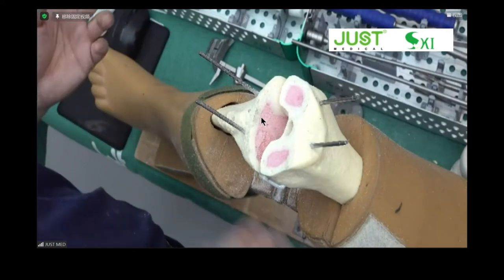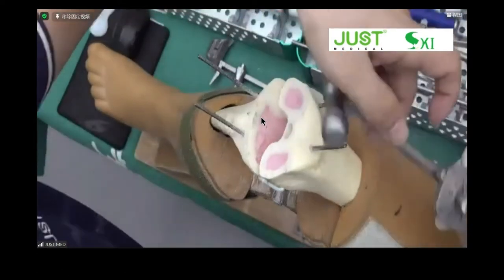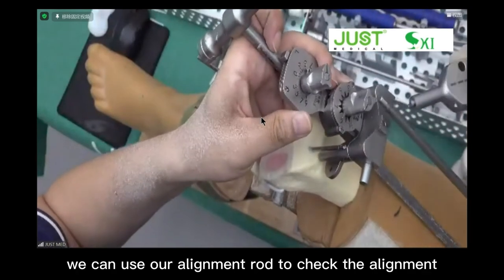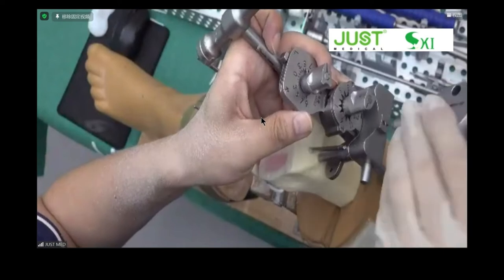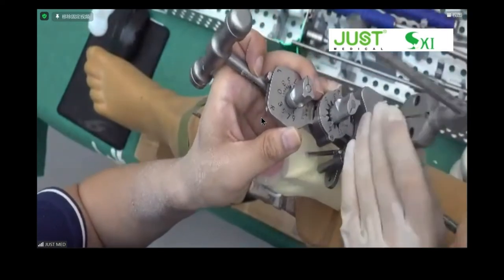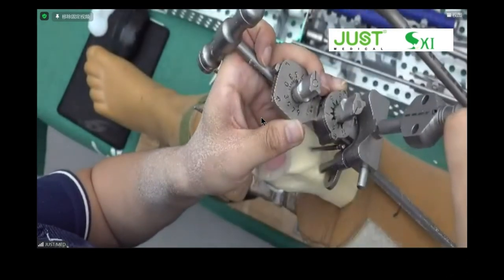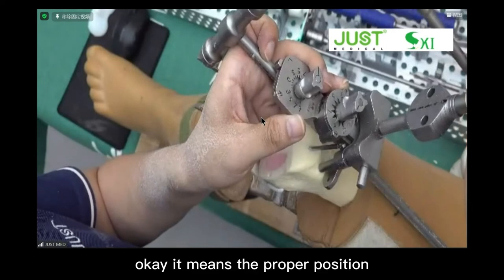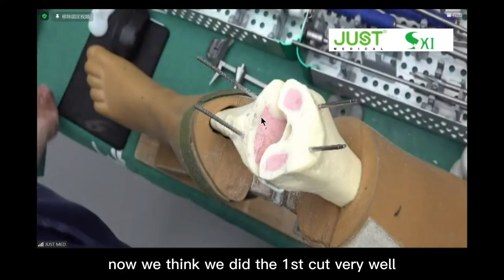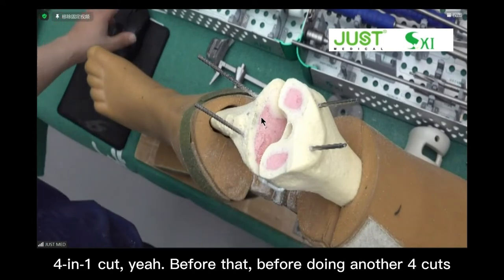Now we check the valgus angle and alignment with the alignment handle and rod. When this is in place, we can use the alignment rod to check the alignment. You have to make sure it points to the femoral head. It means the proper position. Now we think we did the first cut very well, and we'll go ahead and do our 4-in-1 cut.